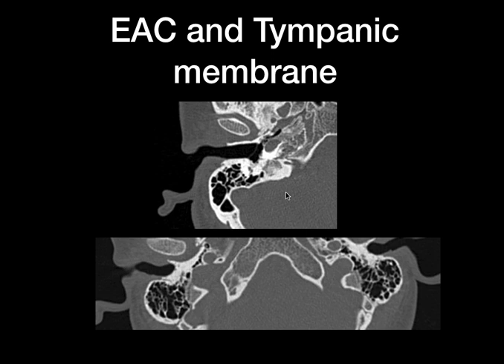Coming to the external auditory canal and tympanic membrane — you can see the bony portion and the cartilaginous portion of the external auditory canal, and the thin tympanic membrane which is intact with no perforation, no defect, and no thickening. Look for any sclerosis of the external auditory canal, exostosis arising from the external auditory canal, and congenital conditions like external auditory canal atresia.